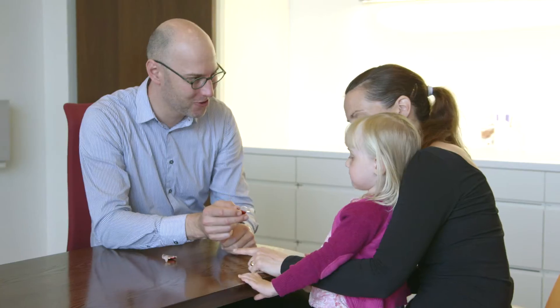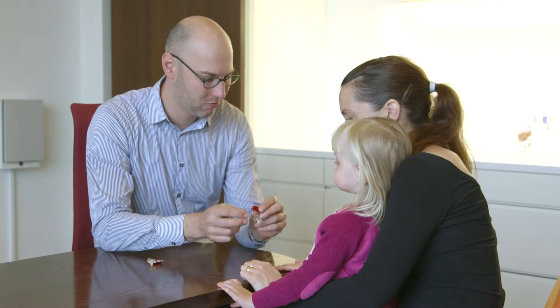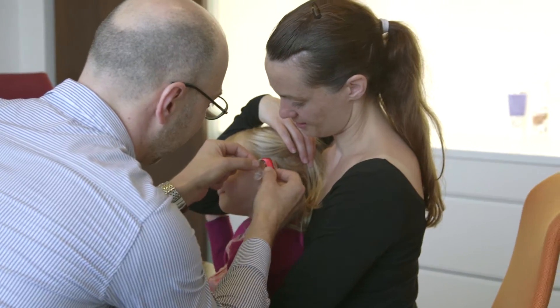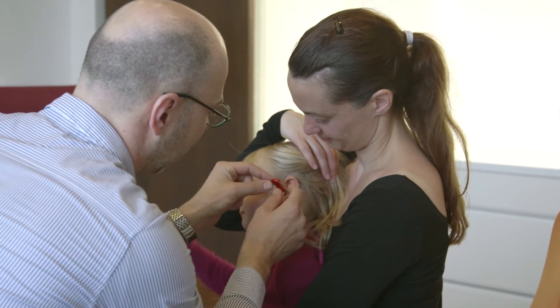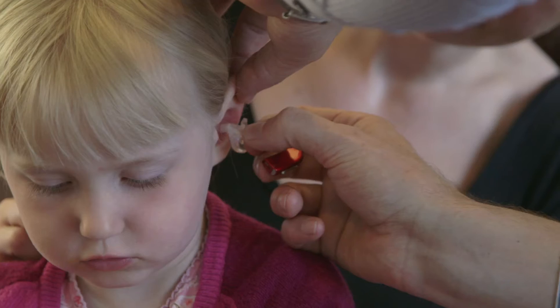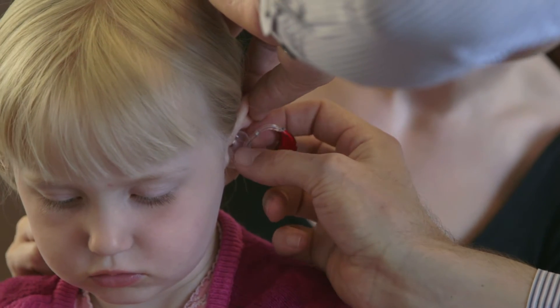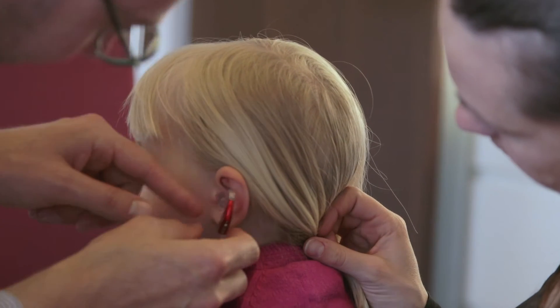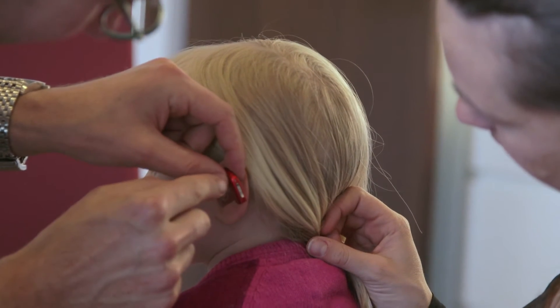The Sensei LED indicates when the ear mould is not in the correct position. Smart Fit Trainer confirms to parents they are inserting the ear mould correctly — it ensures correct ear mould insertion every day. It also helps empower parents in the training of ear mould insertion and assists in troubleshooting feedback issues.